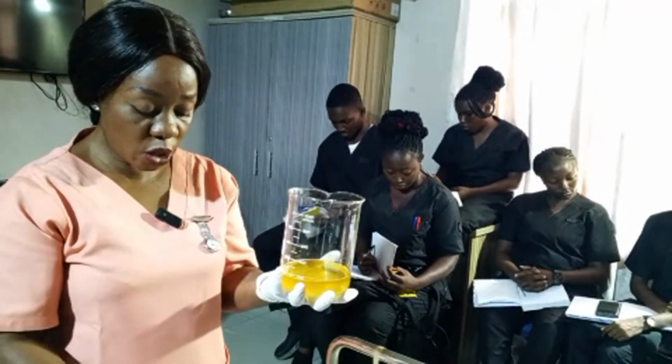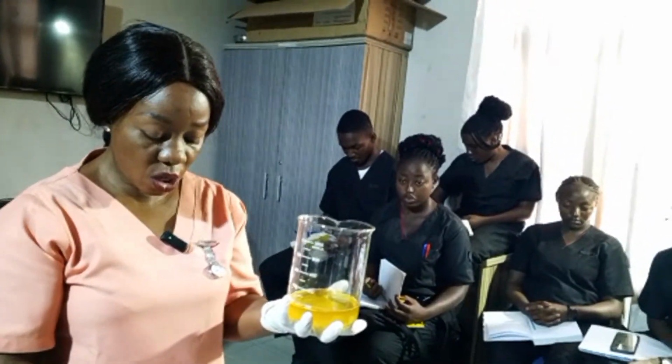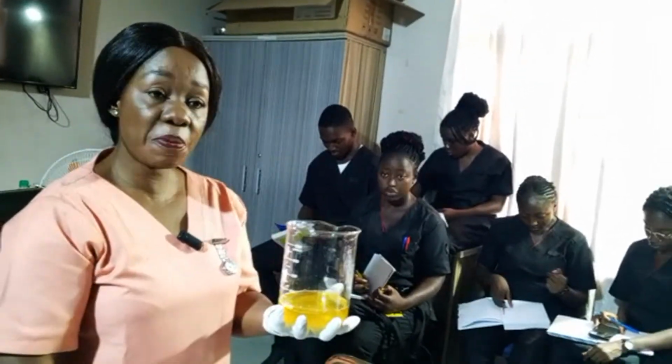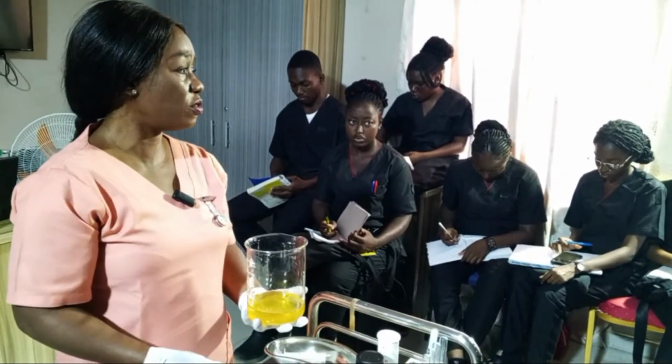The deposit, odor, reaction, color, and amount, right? So I've done what? The deposit, right? Of course, there is some deposit inside the urine. And let me see the odor. I want to know the odor of this urine.